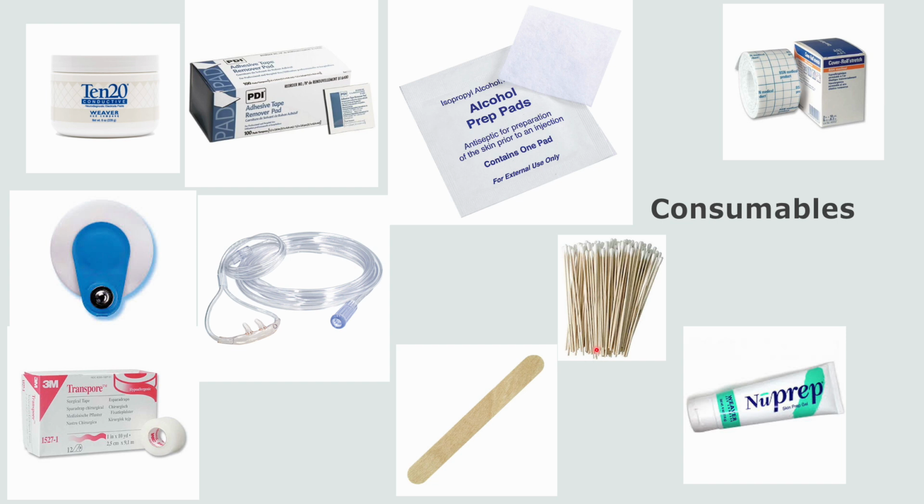You use the long Q-tip looking cotton swab applicators to scrub the skin. You can use a tongue depressor to spread the 1020 paste onto gauze and cover up the electrode that way, also making it stay on a little bit better. If a patient's skin is oily or dirty, you can use alcohol prep pads to clean it up. Once it's dried off, it makes tape stick very well.